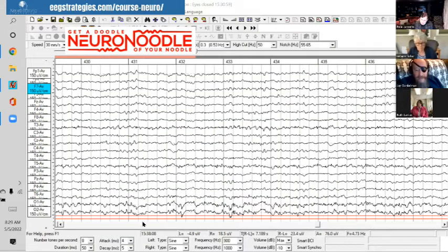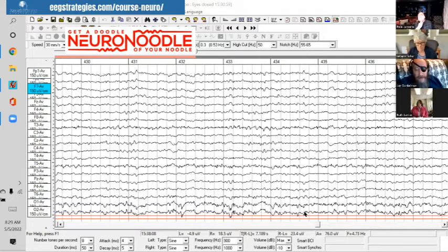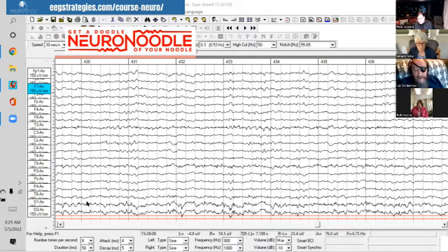The lambda waves at the back of the head tell us the person is visually hypervigilant and their amygdala is overcharged, because this finding is essentially not very common in adults. It's very, very common in young kids looking around, but in adults it's not that common. In PTSD subjects, visual hypervigilance is one of the classic biomarkers. We see this as one of the easy-to-spot signals that the person's got hypervigilance, and that is one of the things associated with PTSD.